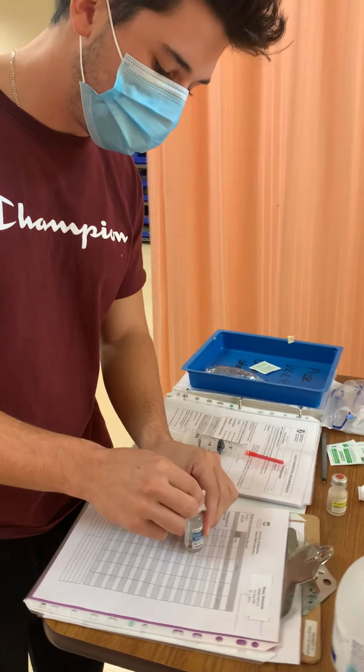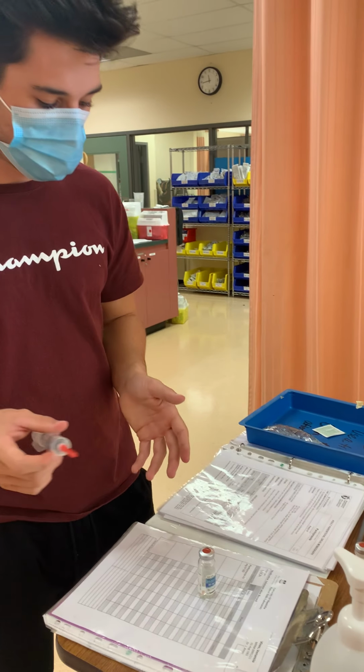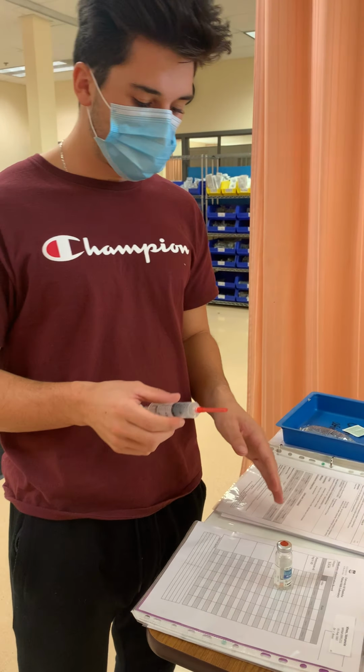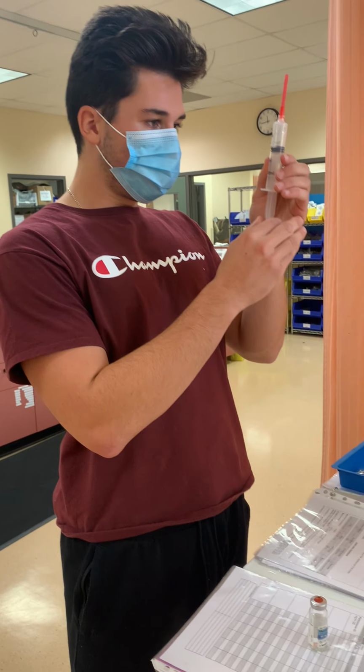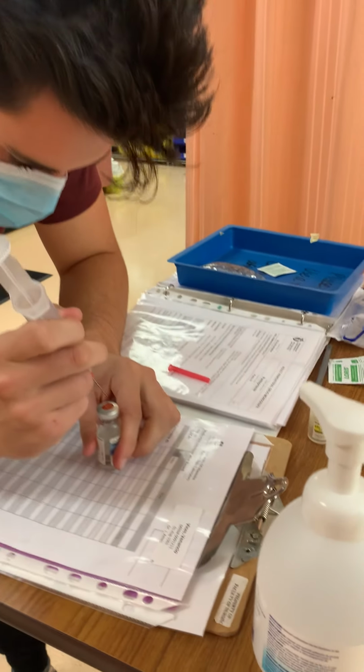So I'm going to swab the top of the vial again for 30 seconds, let dry for 15. Now once I have swabbed it, I can go ahead and calculate my dose while it's drying. So as per PDM, it's a final concentration of 4 milligrams per mL, so that means I'm going to need my 10 mLs to achieve my 40 milligram dose. So I pull up my 10 mLs of air, and I can go ahead and uncap it and inject into my medication.